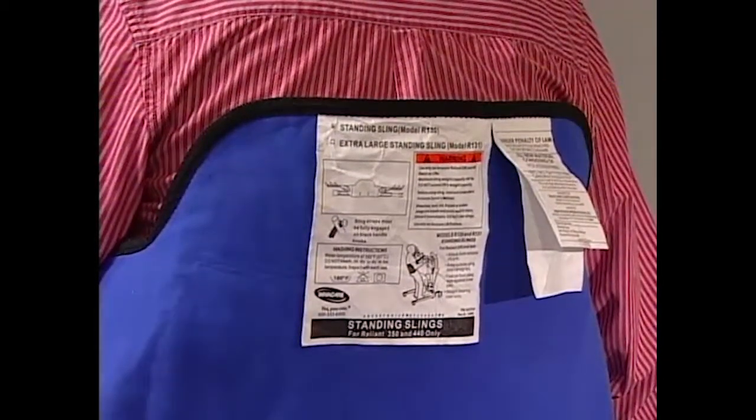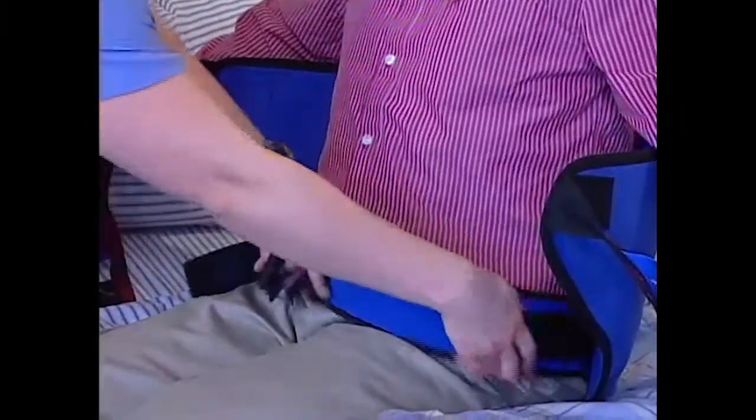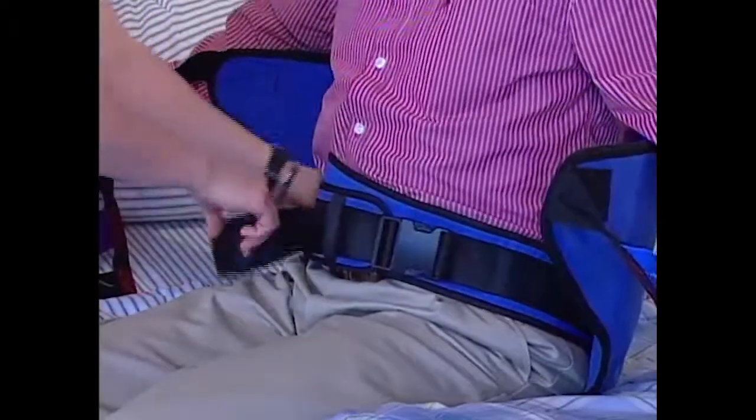The resident's arms must be outside of the sling. Buckle the belt around the resident's waist. Adjust it for a snug but comfortable fit so the resident won't slide out.